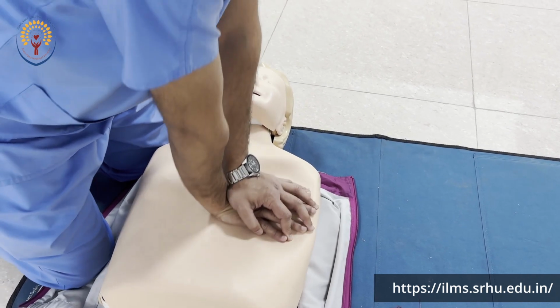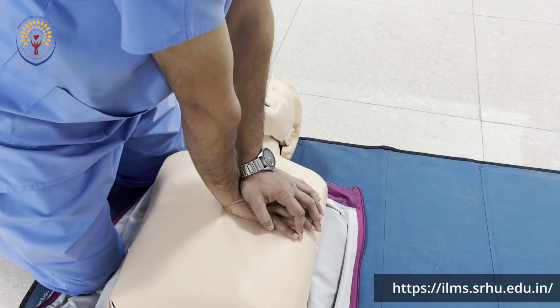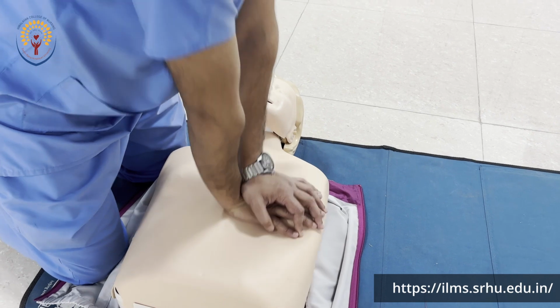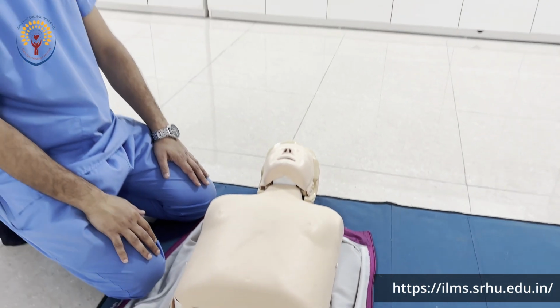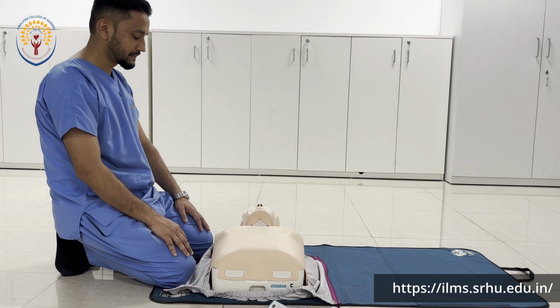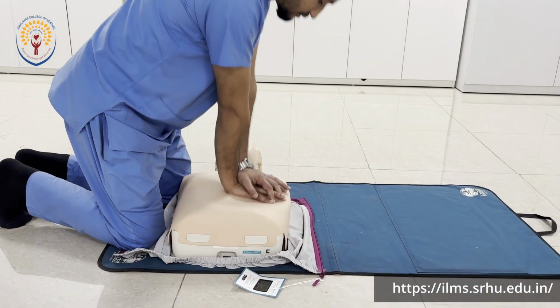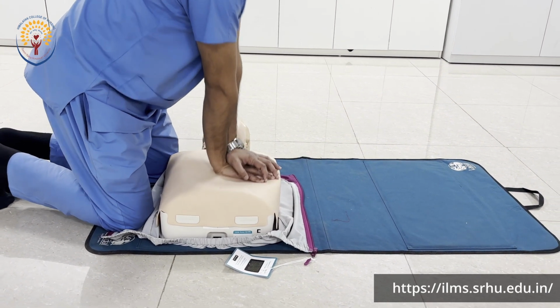Maintain a rate of 120 compressions per minute. And then we should go for 2 breaths, but here we are practicing only chest compression. Now again we will go for one more cycle of chest compression. While doing so, we must count loudly.